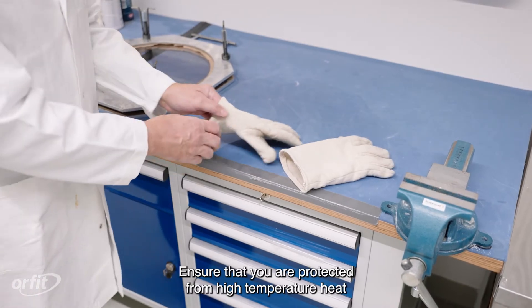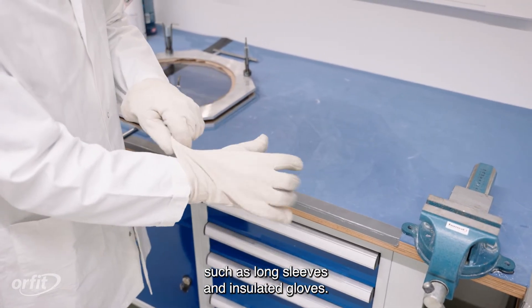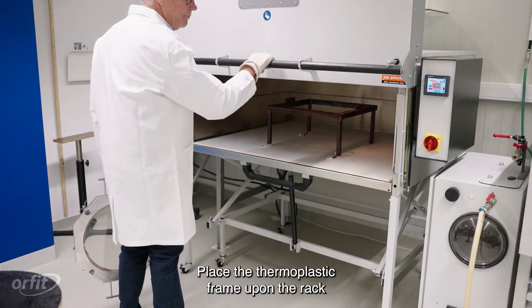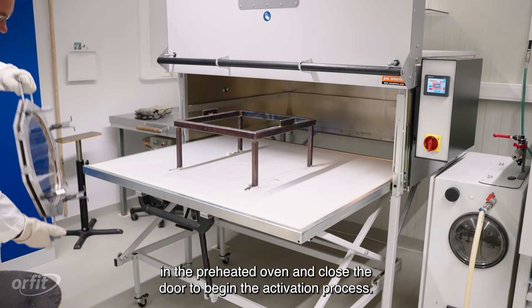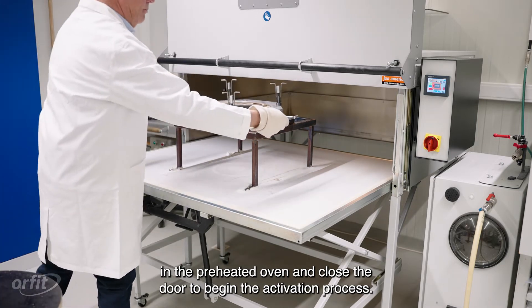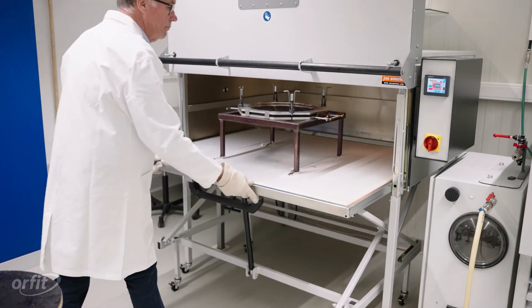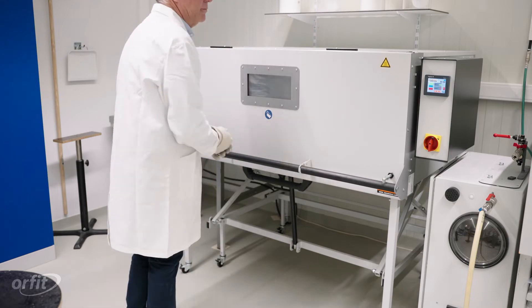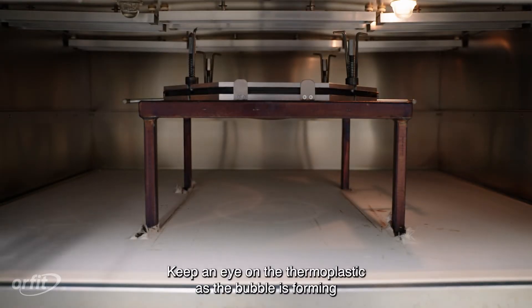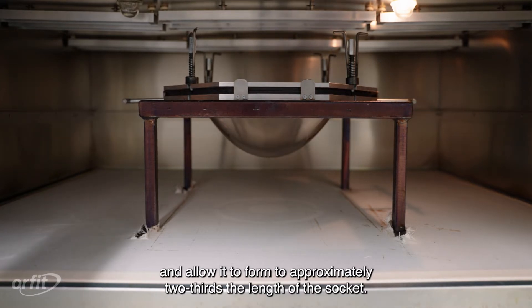Ensure that you are protected from high-temperature heat by wearing protective clothing and gear such as long sleeves and insulated gloves. Place the thermoplastic frame upon the rack in the preheated oven and close the door to begin the activation process. Keep an eye on the thermoplastic as the bubble is forming and allow it to form to approximately two-thirds the length of the socket.